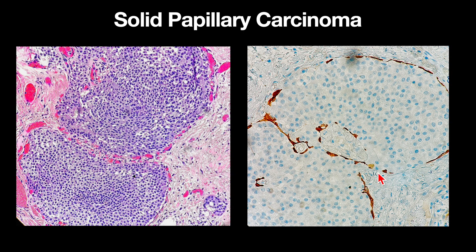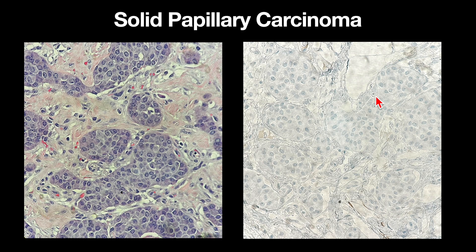Here we see the solid papillary carcinoma where the myoepithelial cells stain the periphery of the lesion and are absent within the lesion itself. Here's another example where you can have lack of myoepithelial cell staining, but this is still staged as pTis as there is no frank invasion. And here you can better appreciate the neuroendocrine quality of the cells.